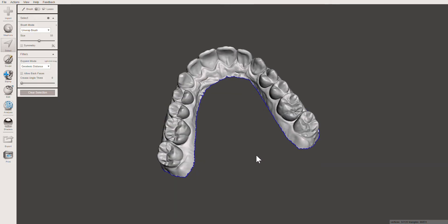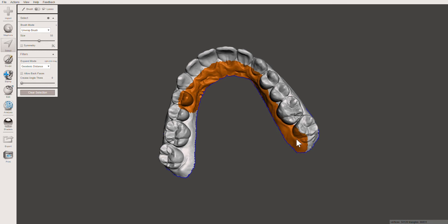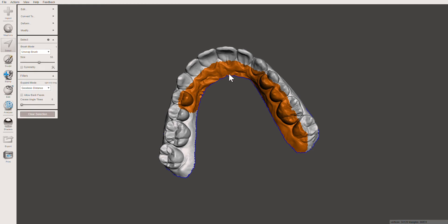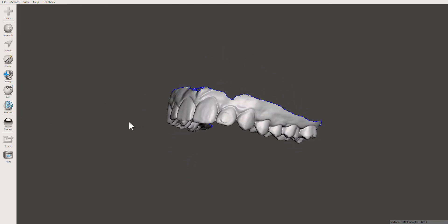If you click directly on the model instead of starting on the gray, you'll accidentally highlight a bit more in a messier approach and might highlight the teeth, which we don't want. So stick with the lasso or the click-and-drag to get nice clean models. If you click on something you didn't mean to, just press Clear Selection or press Ctrl+C.